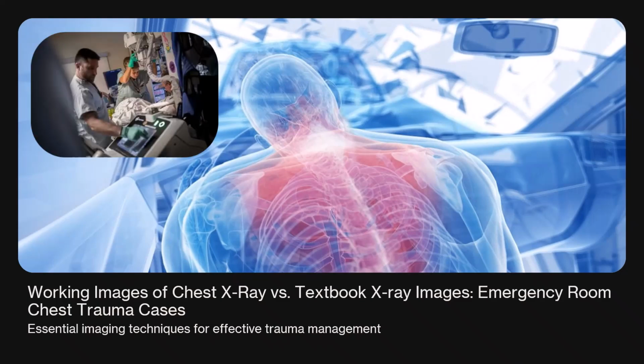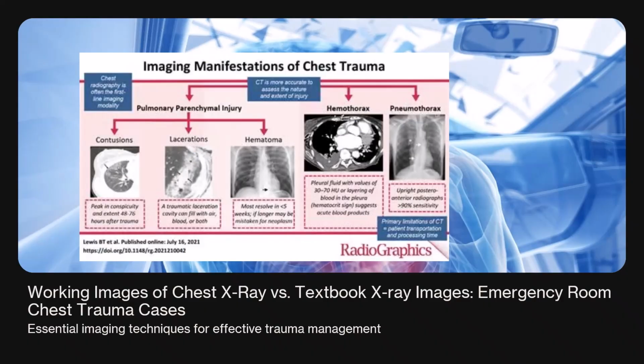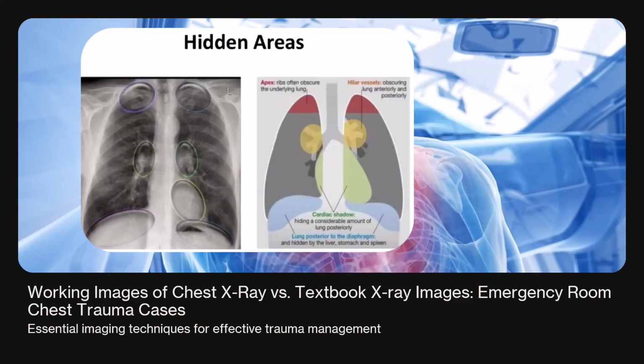Number one is to confirm diagnostic quality with proper exposure, collimation, and patient ID. Number two is to recognize lethal 6 injuries. These include a tension pneumothorax, open pneumothorax, massive hemothorax, a flail chest, cardiac tamponade, and airway obstructions.